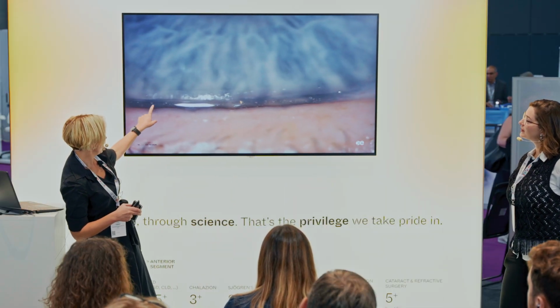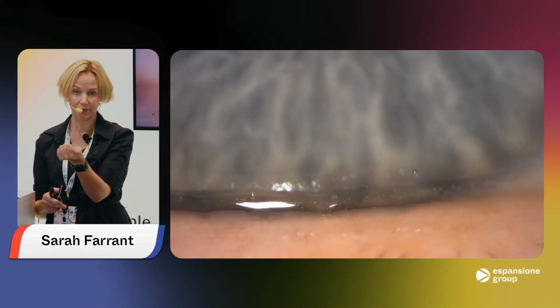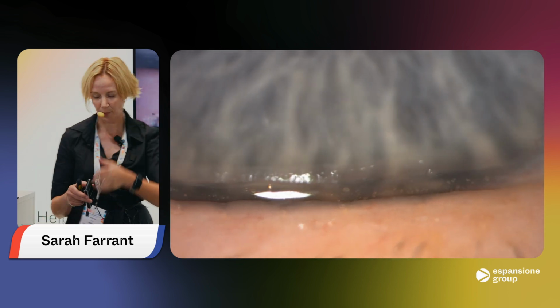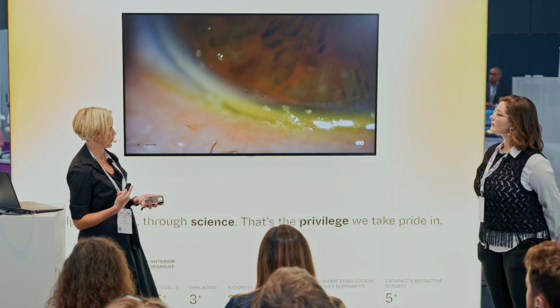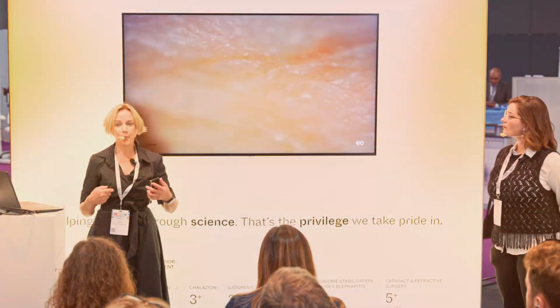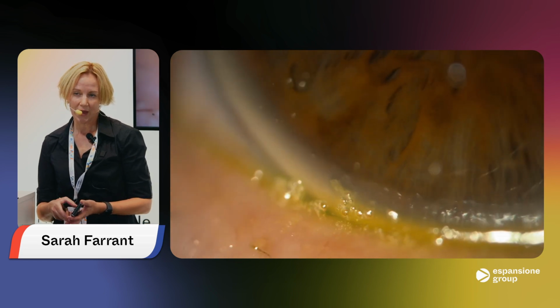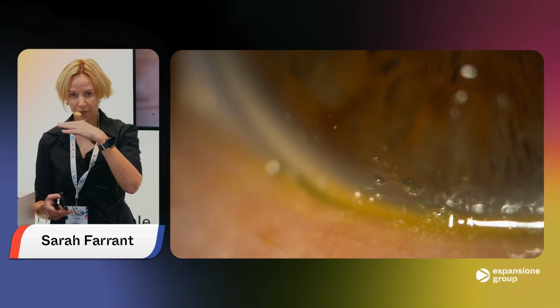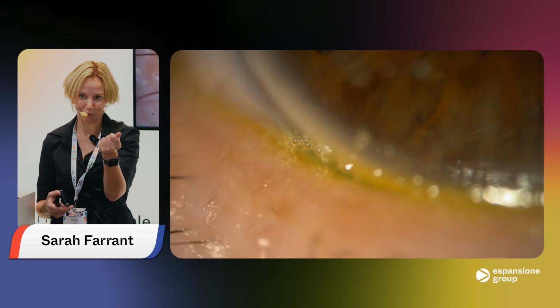So what you have here, floating in the tear meniscus, are what we call lipid bergs, and these are basically like little icebergs of lipid. And because the lipid composition is altered, it's now no longer mixing with the tears, and so you get these isolated clumps of lipid, which can be confused with saponification. This is true saponification. So what you see now are bubbles, literally little foamy, frothy bubbles, and you can provoke them as well. So if you look at a lid margin, when you start to know what to look for, you can look at the lid margin before you express, and I'm a massive fan of expression, and you'll see not too much going on, nothing too obvious.